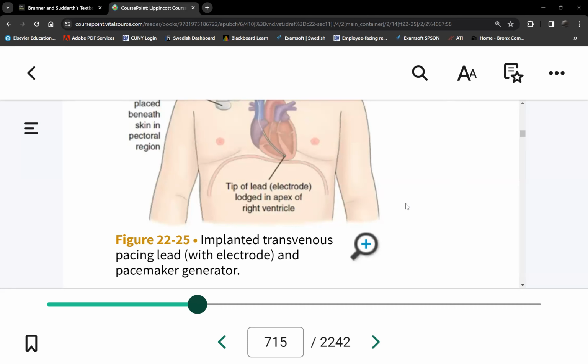It can be used overnight, say 8 hours or up to 12 hours, until we can do permanent pacemaker insertion the next morning. So all permanent pacemaker insertion procedures are done during business hours. You understand? So none will be done overnight. Like the doctor who inserts it does not come after business hours, right? Because there's no need, because we have a temporary pacemaker.